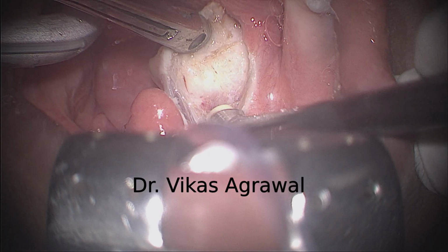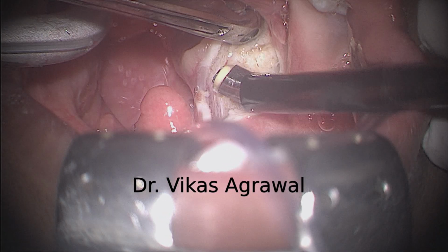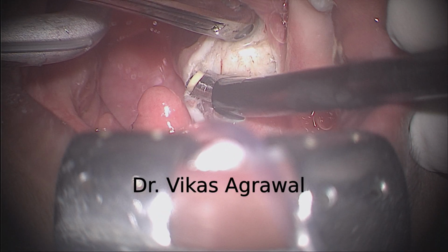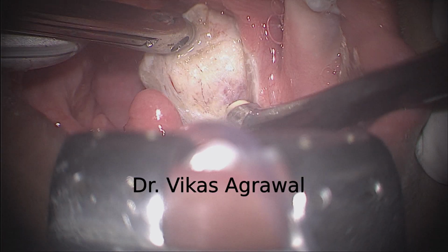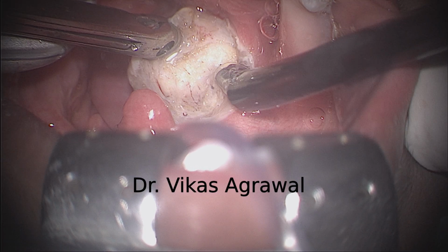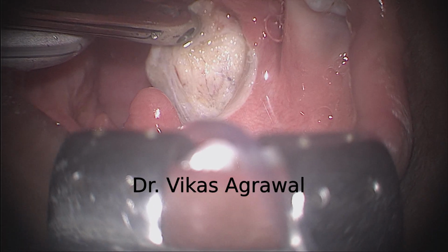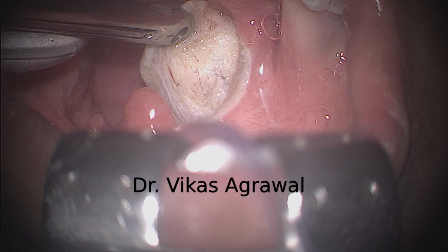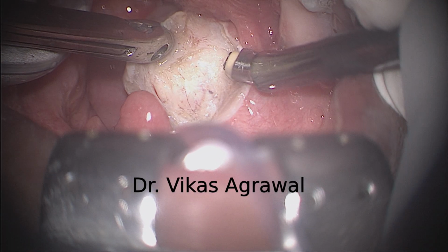That's called endophytic tonsil, and these are the small blood vessels which I'm coagulating. All the small blood vessels are being coagulated so that there is no bleeding after. Can you focus it better? Is it focused? All right. Thank you.